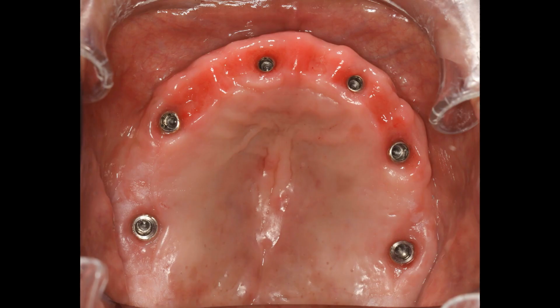This is one of the slides I wanted to get to. Anxiously awaiting my comments about this. So you remember this patient had significant bone loss, significant tissue recession, and had what I said in the beginning was good keratinized tissue. Because we handled each step along the way properly, look at how beautiful these tissues are. We've been able to recreate some of the natural contours, but mostly I just want you to appreciate the volume of good, healthy tissue by not removing bone and not removing tissue like so many of our competitors do.